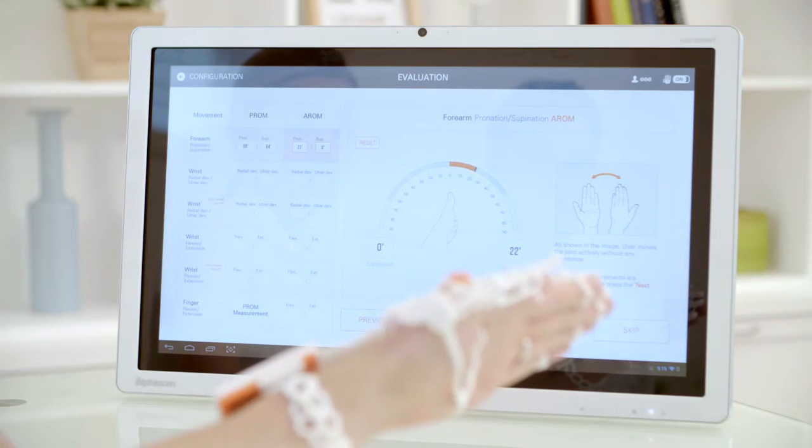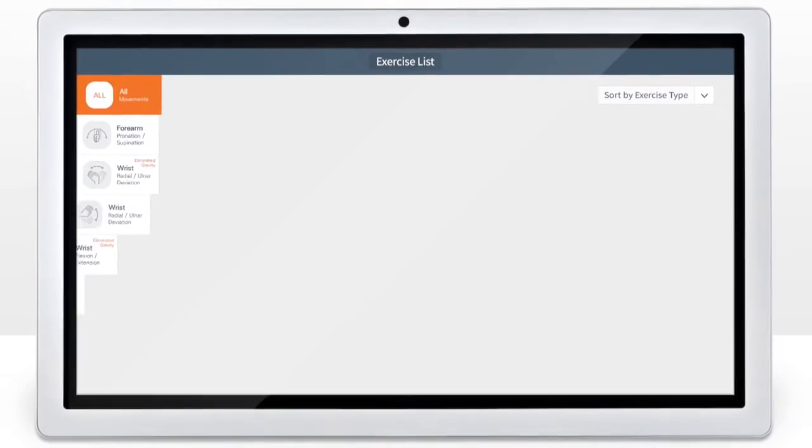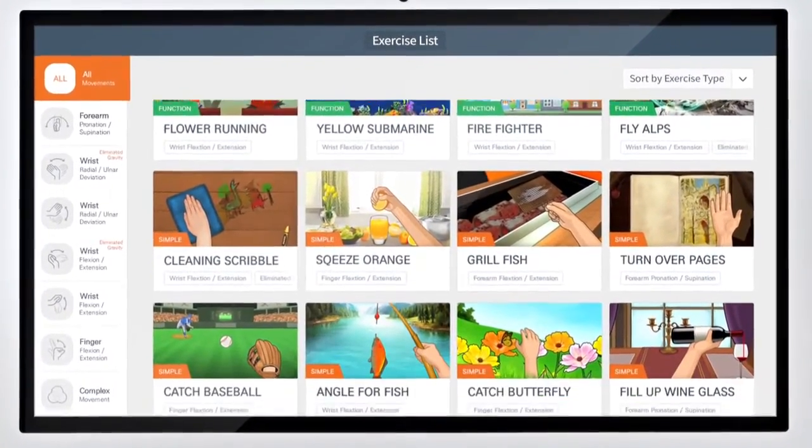It is a system built using IT technology. The sensors in the glove are used to measure patients' movements and provide a new rehabilitation experience based on diverse exercise content.